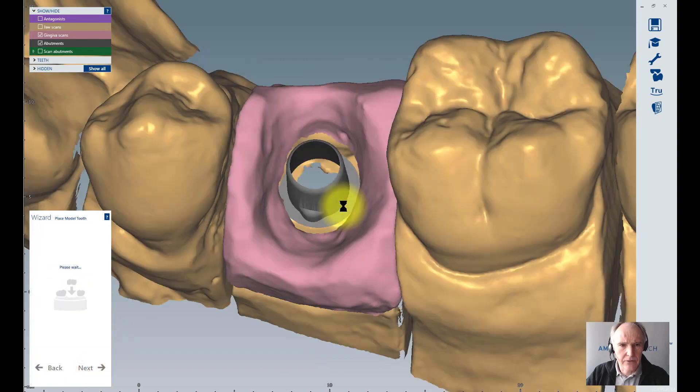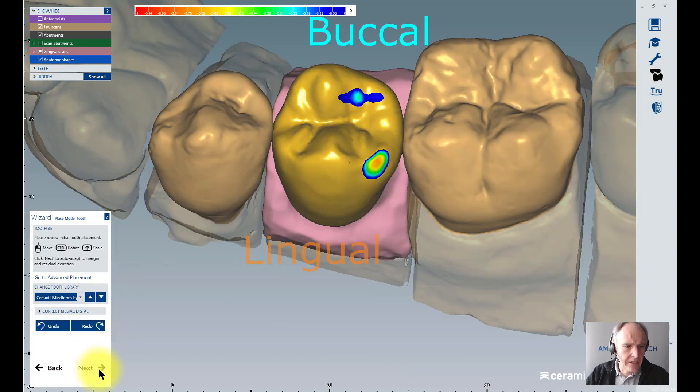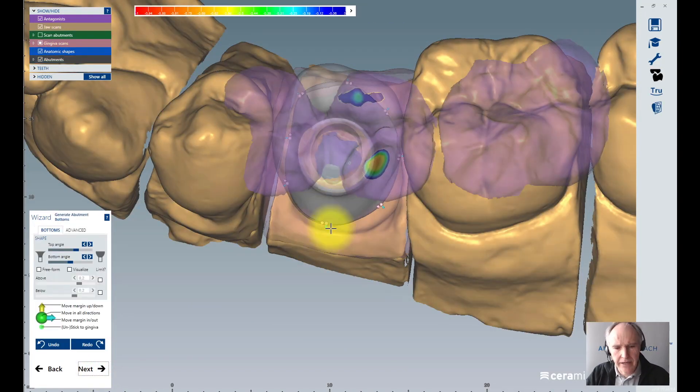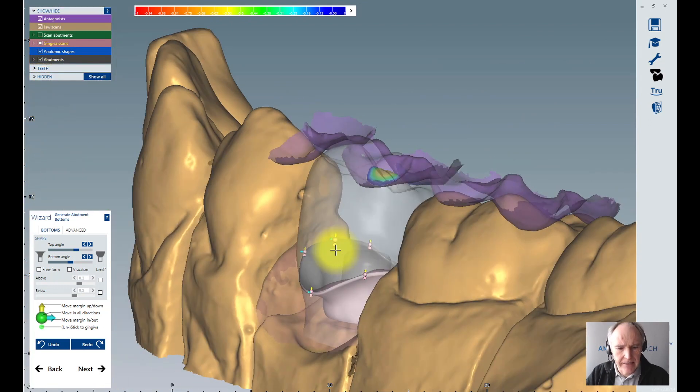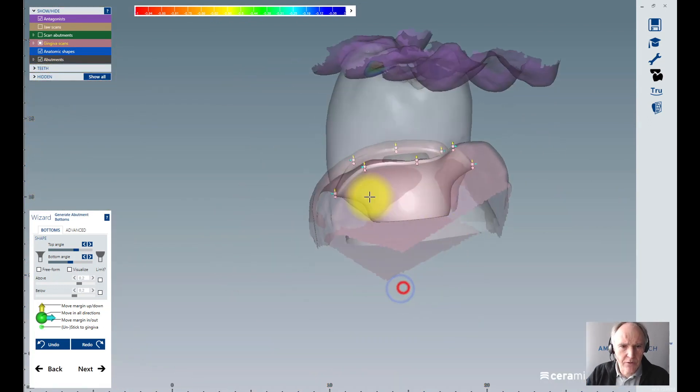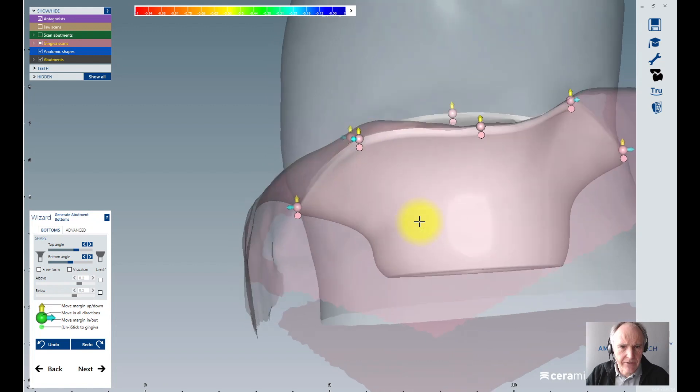We are going to place our library tooth. After positioning I click on next. Now I come to the point where I adjust the fitting between my emergence profile and my gingiva. Let's have a closer look.